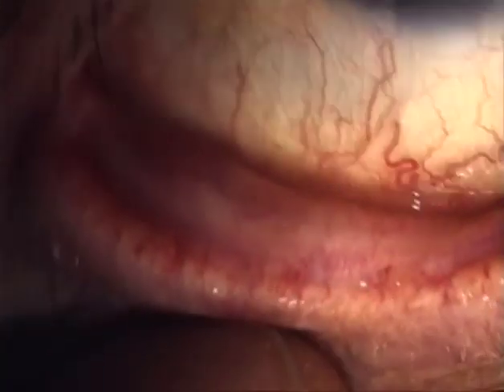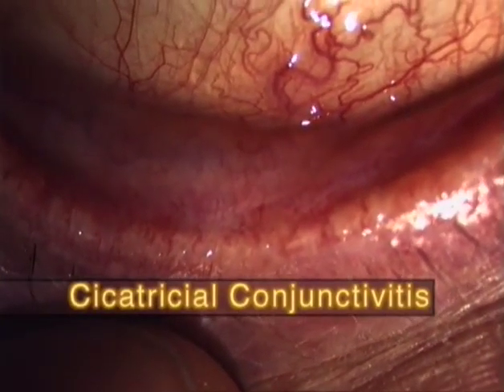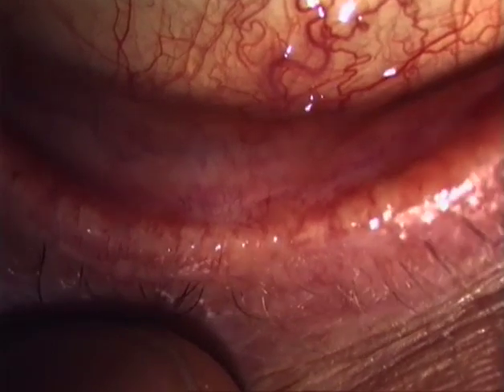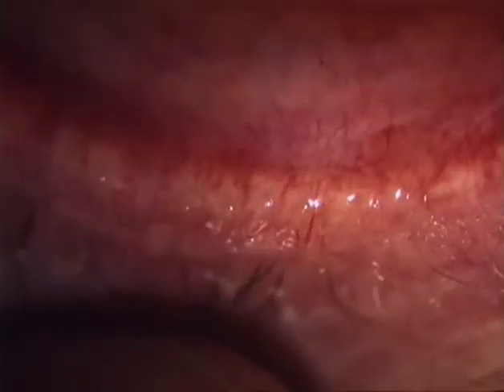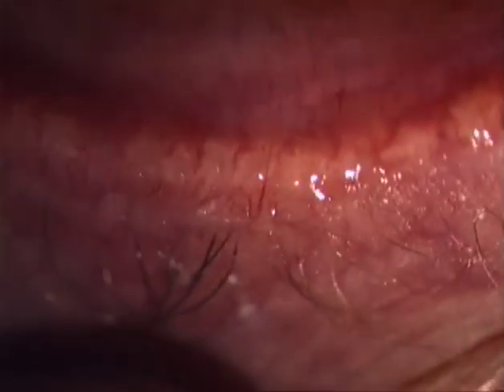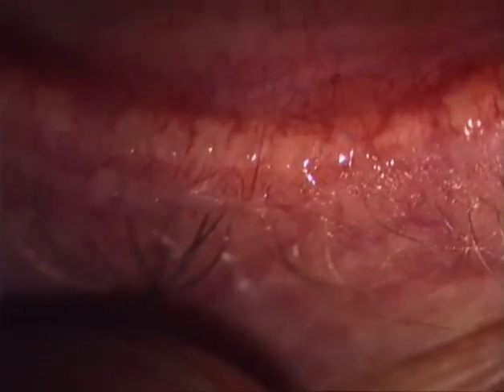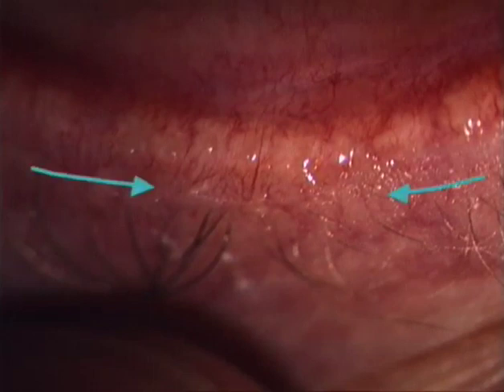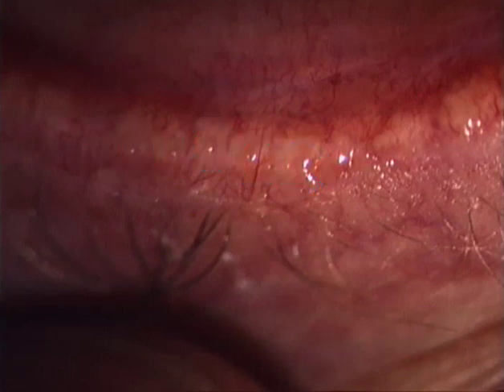On the other hand, the border may be dislocated outwards, as in this case of cicatricial conjunctivitis. The wet reflex can be seen extending to the outside, and the dry reflexes end external to the lashes. As a result, the mucocutaneous border has been shifted in the opposite direction, that is, towards the skin, and the orifices of the tarsal glands are facing towards the conjunctiva. Thus, the sebaceous material is secreted directly into the conjunctival sac.